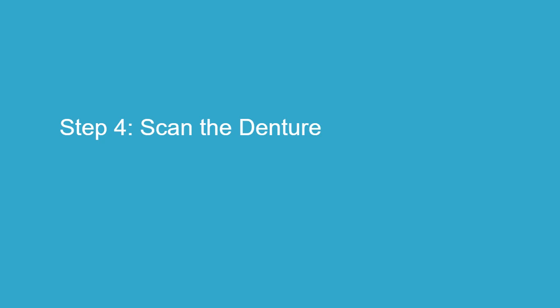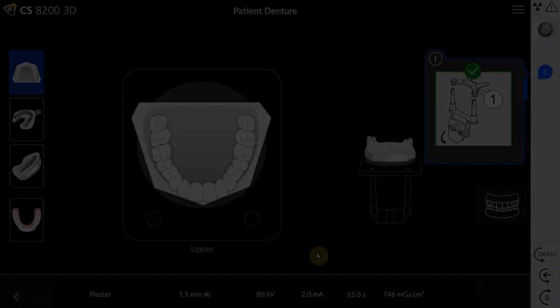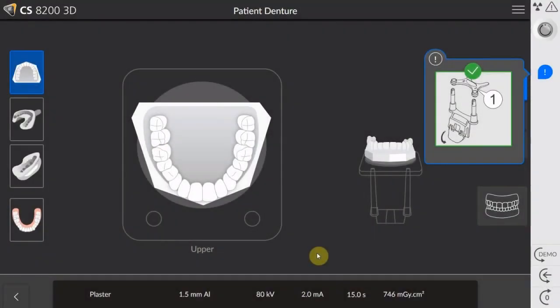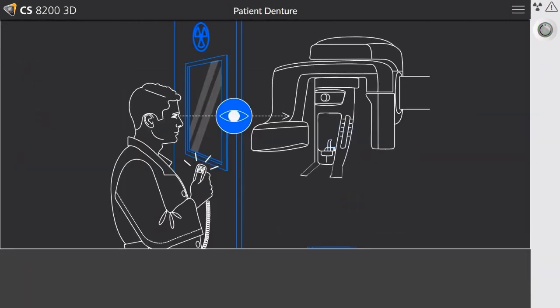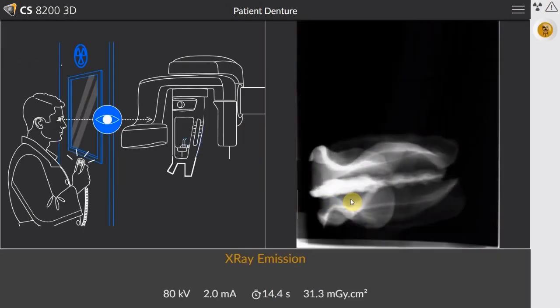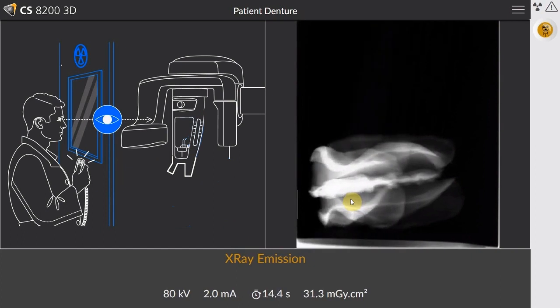Step 4: Scan the Denture. Next, perform the actual scanning of the denture. Select Appliance Mode and initiate the appliance scan using the hand switch. The CBCT machine will then scan the dentures.